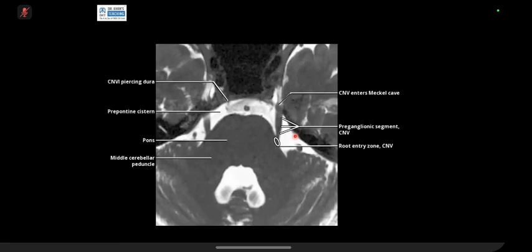I am not going to teach you the sensitivity and specificity of various signs, which I feel is slightly beyond 2B. This case is at the boundary between, is it a 2B case or too specialized? But I selected it for the simple reason that I can teach you anatomy very well on this case. And this is the concept of teaching anatomy using pathology. What I'm teaching you is slightly beyond 2B.